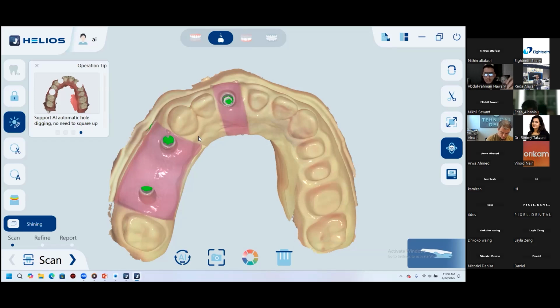So this is actually a clinical scenario that you used to reach the final reference, and you confirmed this scenario by communicating with your lab. So you could just go ahead and try something like this, and we could communicate together while trying it within the case. So please share with us the type of case, whether photos or primary scans, and we would plan it together. Okay. Thank you very much, doctor. Thank you.